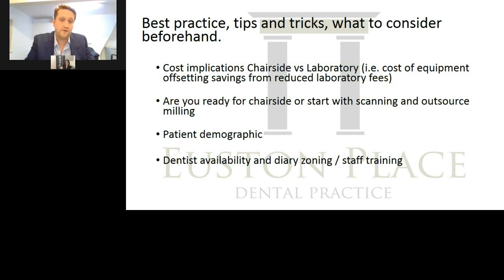Or, I know some people I've spoken to have just gone for the whole shebang straight off and jumped in with both feet and bought scanners, mills, printers, implant software, everything all at the same time, which, if that's what you want to do, it's a learning curve, but it works well. Actually, it's not as much of a learning curve as it was a few years ago, so it's a lot easier, especially with things like the design studio.